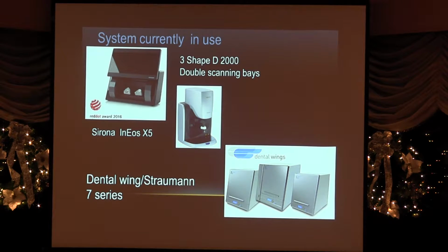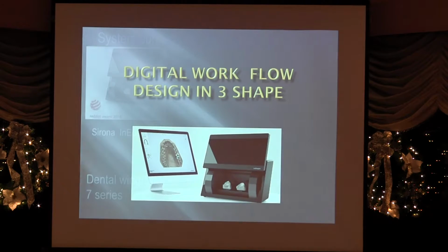Now, in the lab, we have all three scanning systems, but as Dr. Martin said, 3Shape is our go-to system. We do receive directly from CEREC and Dental Wings systems, but every single intraoral scan we always convert to 3Shape, because their design software is so robust that we can design, and this is Dr. Martin's favorite design system also. So the case I'm going to be designing is going to be in the 3Shape design system.